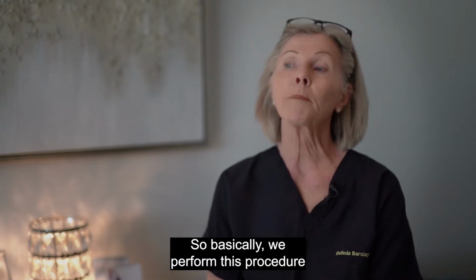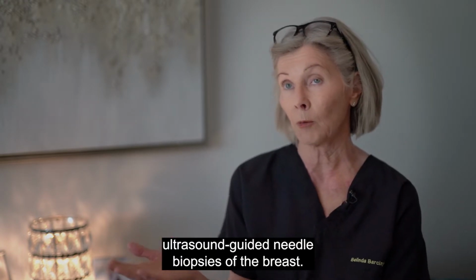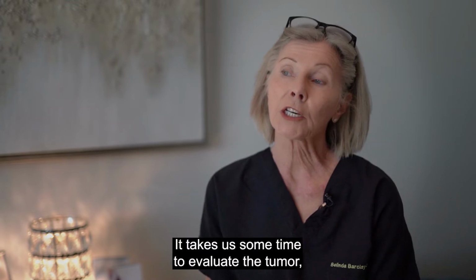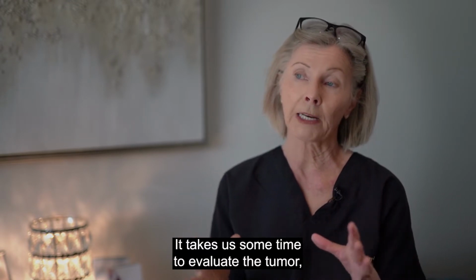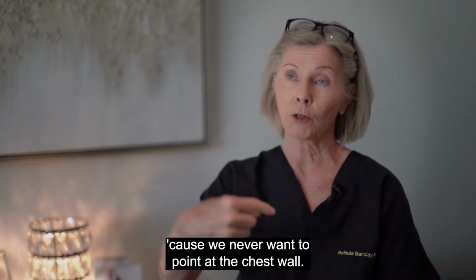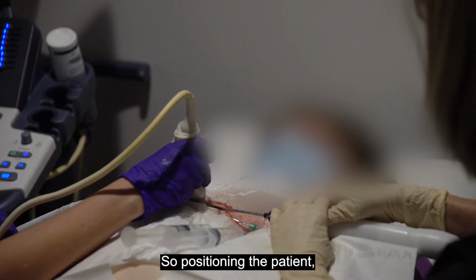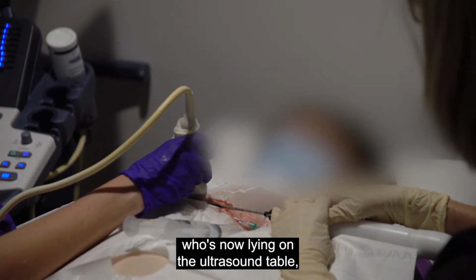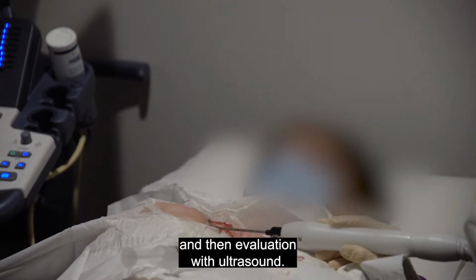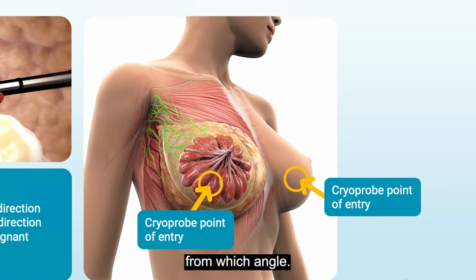So basically we perform this procedure in the same room that we perform ultrasound-guided needle biopsies of the breast. We use local anesthetic. It takes us some time to evaluate the tumor and see which direction we're coming from, because we never want to point at the chest wall. We always want to come parallel with our probe. So positioning the patient, who's now lying on the ultrasound table, and then evaluation with ultrasound: size of the tumor, where it is, how I'm going to approach it, from which angle.